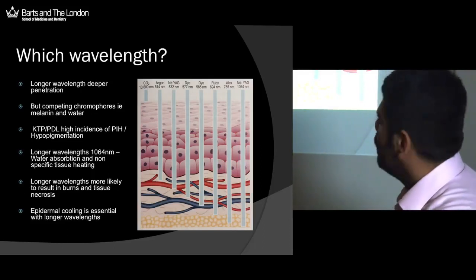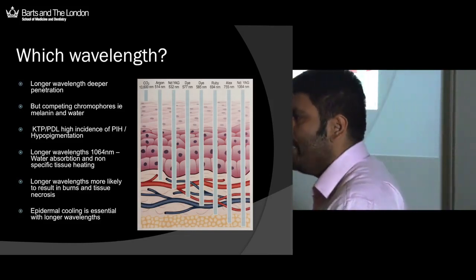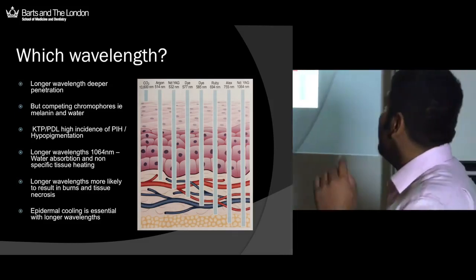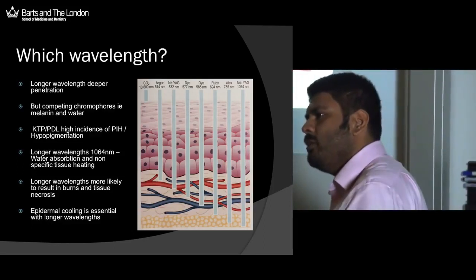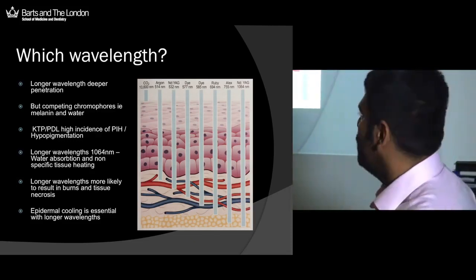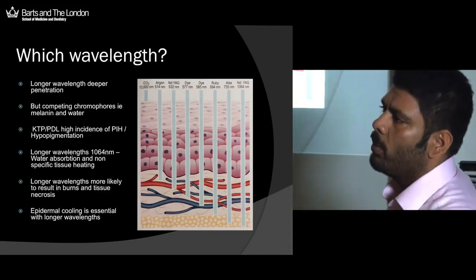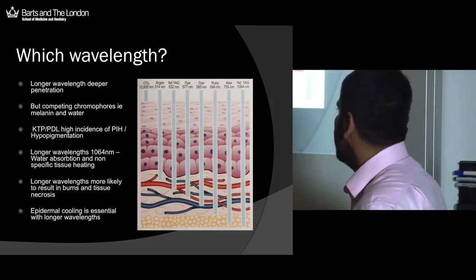So by far the best laser here for the treatment of leg veins is the Nd:YAG. It's also very poorly absorbed by melanin. Melanin absorbs light very well in the 400 to 700 nanometer wavelength range. If you use pulse dye lasers and KTP lasers, you are much more likely to photostimulate the area and get pigmentation due to good melanin absorption. And that's not what you want. You don't want brown circles on the leg. So with the Nd:YAG, you're very safe because it is very poorly absorbed by melanin. So you cause damage to the vein, you don't cause much damage to anything else.